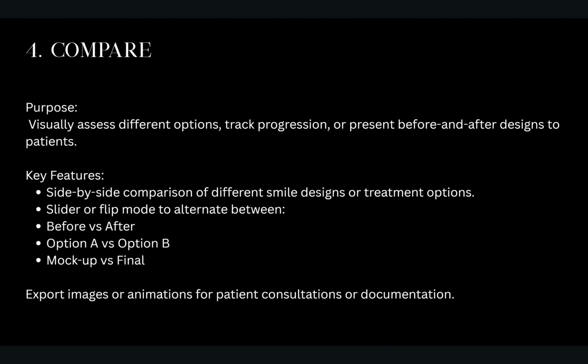And the feature number 4 is compare. The purpose of this is the ability to assess different options, track progression, present before and after designs to patients. It's pretty flexible. It's something, admittedly, I don't use that much, but something that I should use more, because you can use the key features for side-by-side comparisons of different smile designs and treatment options.